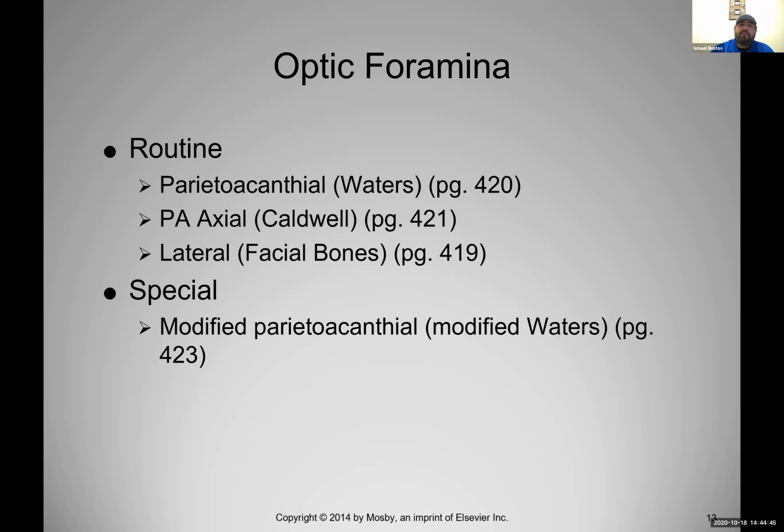Now, we're going to talk about the optic foramina or the orbit, right? So they call it orbits. You may hear it as optic foramina, but it's kind of interchangeable, right? But it's more the orbits projection is what we're looking for. Okay, so for the orbits, this is going to be the routine here.